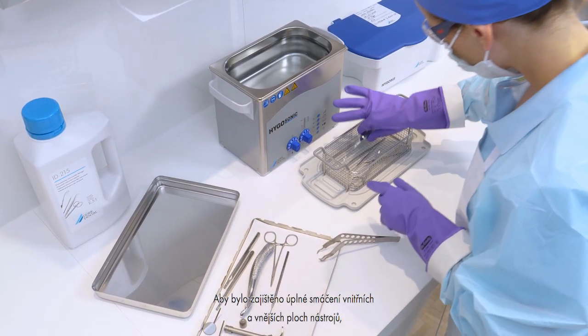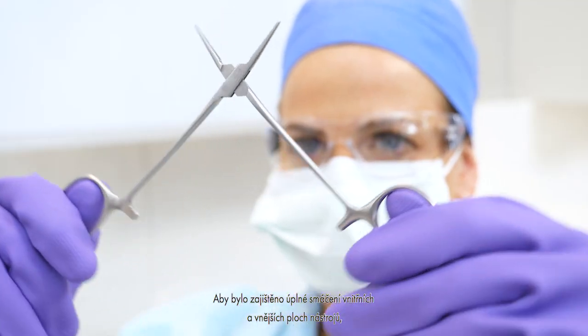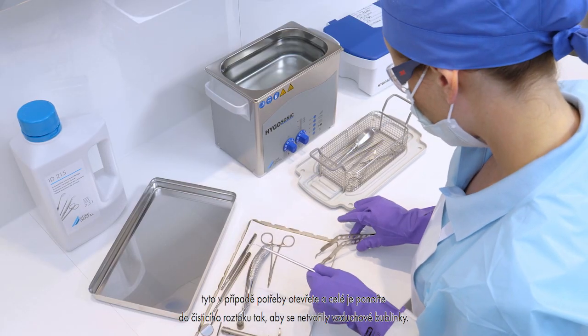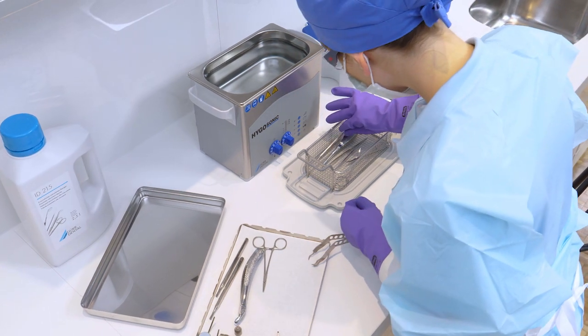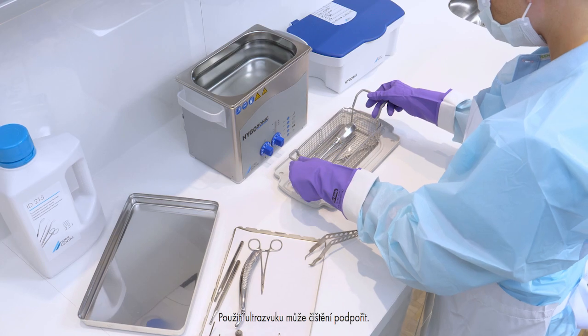To ensure complete wetting of the inside and outside surfaces of the instruments, open the instruments and immerse them completely in the cleaning solution without air bubbles. The application of ultrasound can increase the cleaning performance.